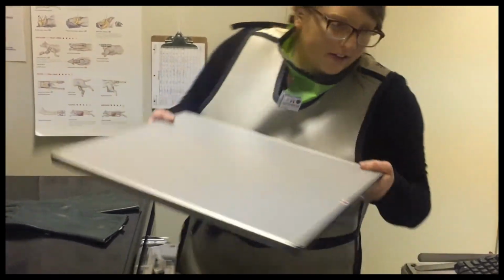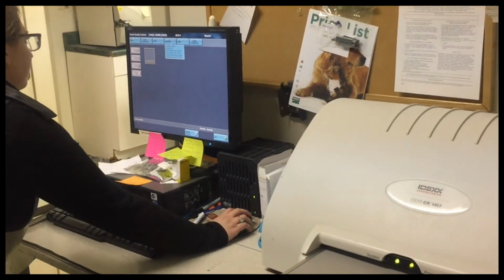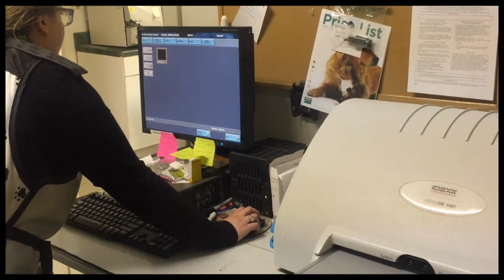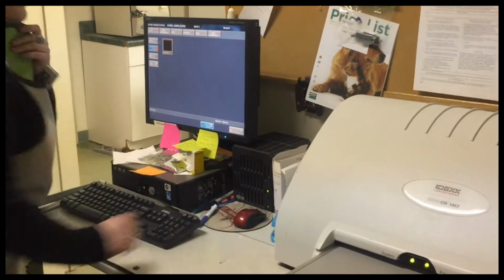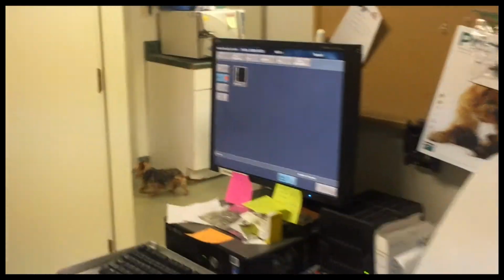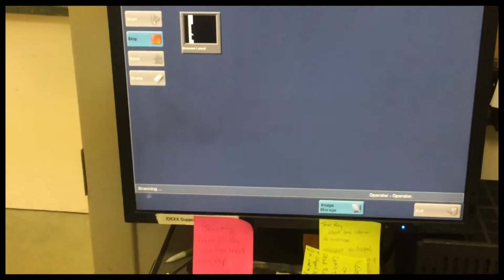For a dog, a right lateral and ventrodorsal every 30 minutes until contrast agent reaches the colon and completely leaves the stomach or an obstruction is identified is ideal. For a cat, do a lateral and ventrodorsal image every 15 minutes, 30 minutes, at 60 minutes, and every 30 minutes until contrast reaches the colon and completely leaves the stomach or an obstruction is identified.